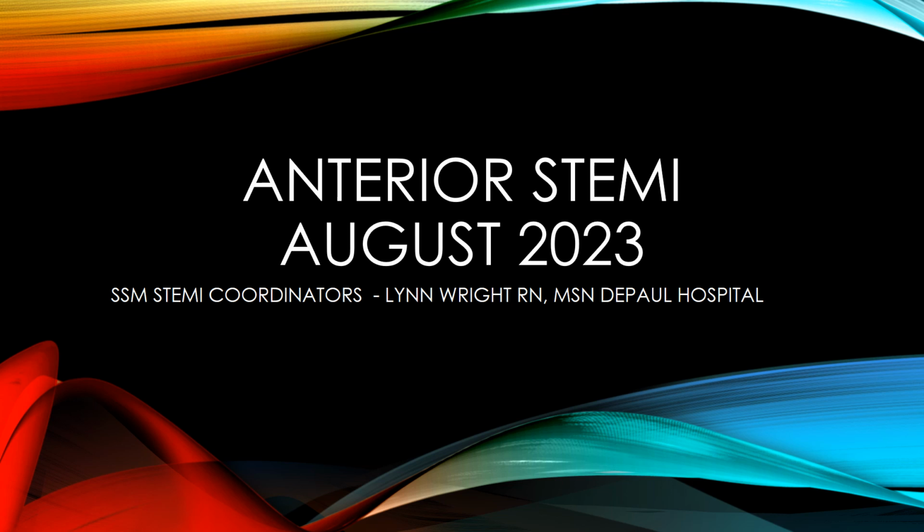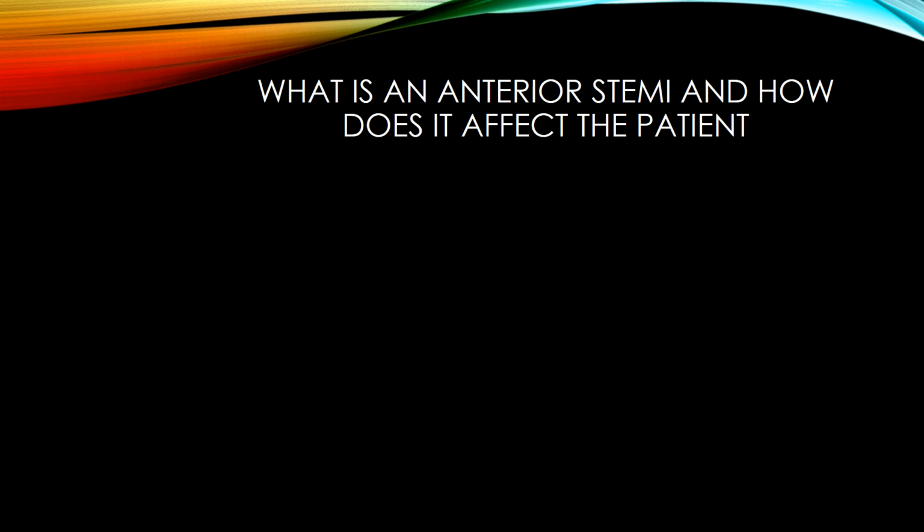Anterior STEMI. What is an anterior STEMI and how does it affect the patient? We will go over 12 leads, how to read a 12 lead and tell you're having an anterior STEMI, the effects on the patient, what happens in the ED and cath lab.